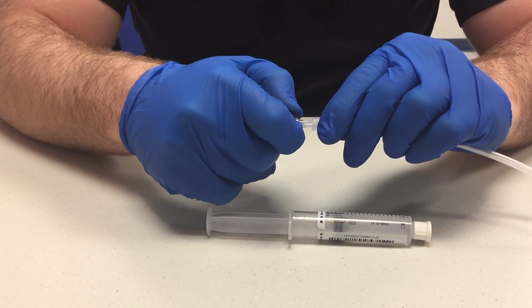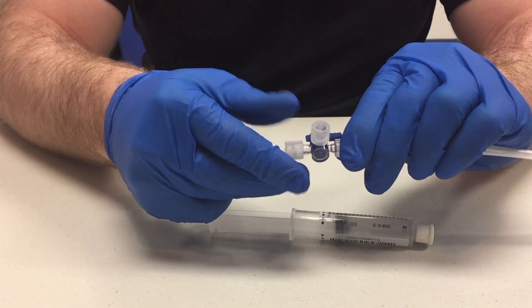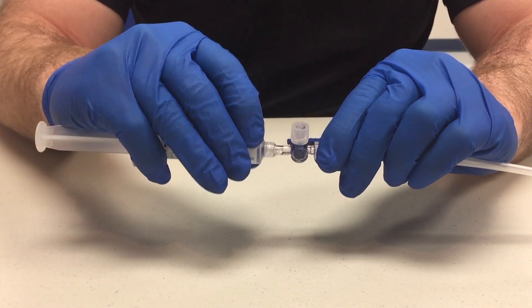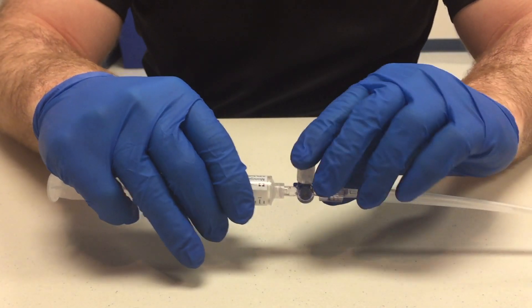Assemble your equipment first by attaching the stopcock to the catheter, and secondly by attaching the saline flush to the opposite side of the stopcock. Then flush the entire stopcock and catheter to push all air out of the system.